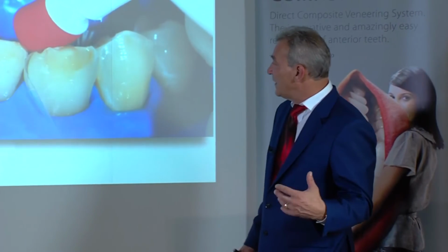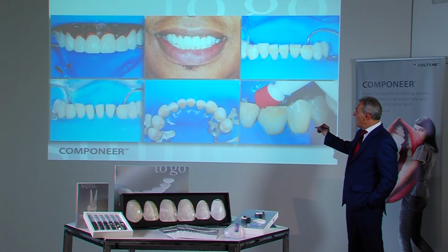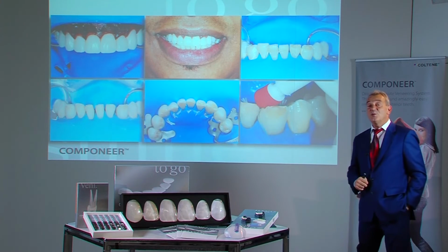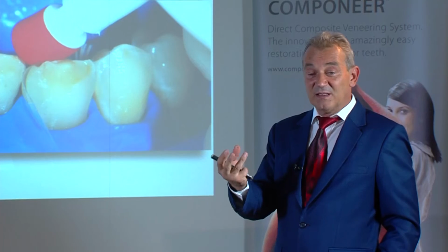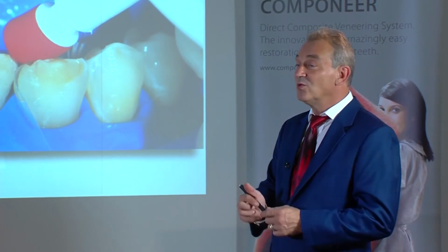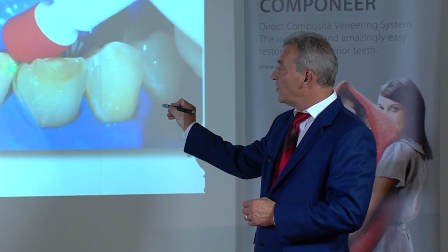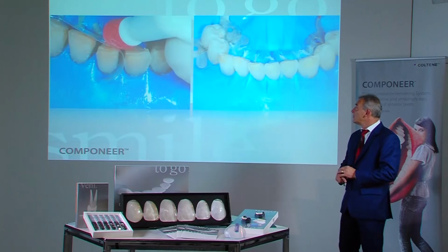Contact points can be created in different ways. There are domed matrices, but one can also use straight matrices. This place is suitable for creating an attractive curvature and especially not to produce too much palatal and lingual excess. It is fitted with a silicone stud, which has a curvature corresponding to the palatal and lingual curvature. This allows pressing the composite down to create the base and the background for componeer.